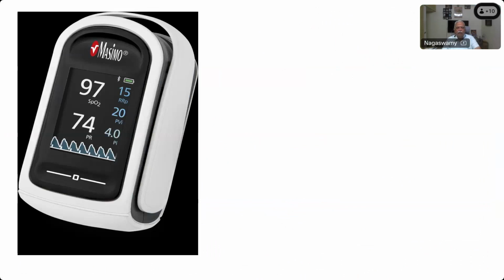So, what is this? Pulse oximeter. Pulse oximeter, with what are all the features that you are seeing? What is Masimo? First, the top portion is written as Masimo. What does that word mean? It is the company which made this. Masimo pulse oximeter. It is the company which invented this technology. What is the technology that they incorporated compared to the earlier pulse oximeters?